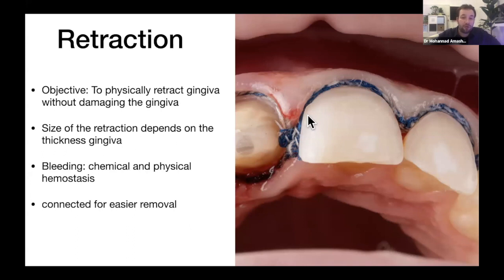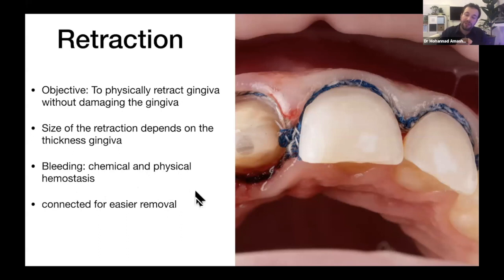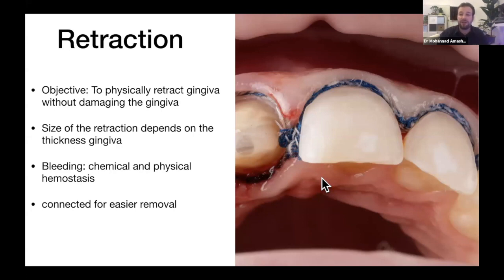Physical retraction is essential. You can also use retraction paste, but the most important factor is moisture control — including bleeding. Use adrenaline-impregnated cords and think carefully about cord size, which will also physically compress the gingiva slightly to help stop bleeding. For efficiency, connect your retraction cords so they're easier to remove — instead of placing ten individual pieces for ten teeth, I instruct my nurse to cut them into connected groups, so I only have to remove three pieces instead of ten. Always keep a handle for removal.